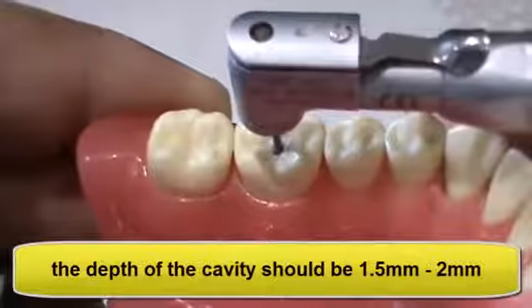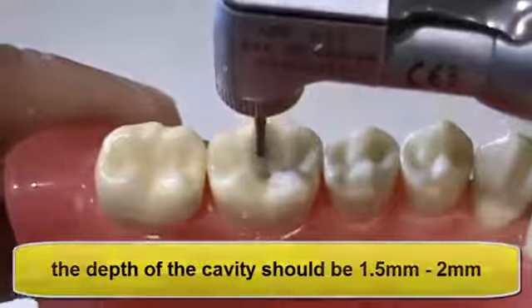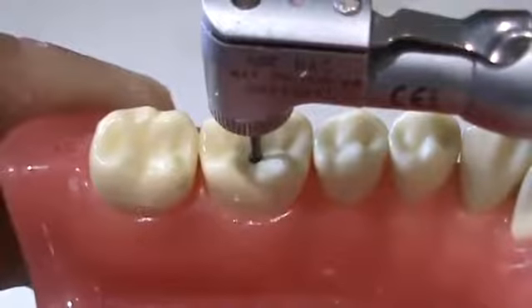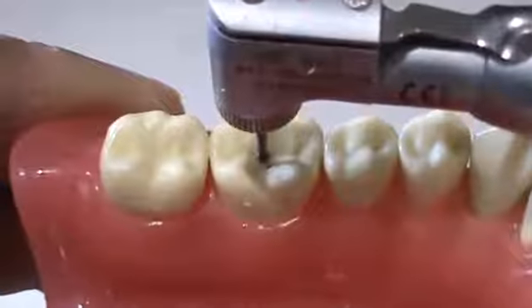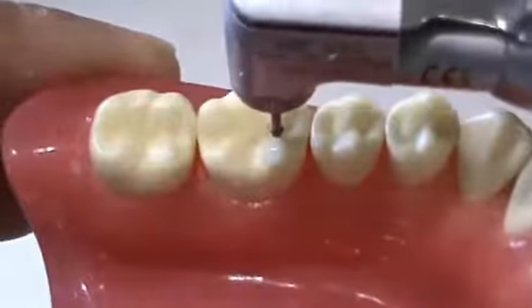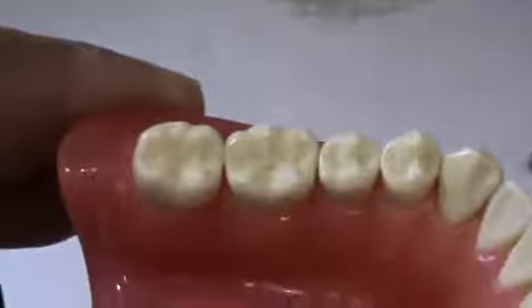The depth of the cavity should be 1.5 mm to 2 mm. After cutting, we could check the cavity depth by placing the burr in the cavity. We should see that the burr sinks into the cavity.